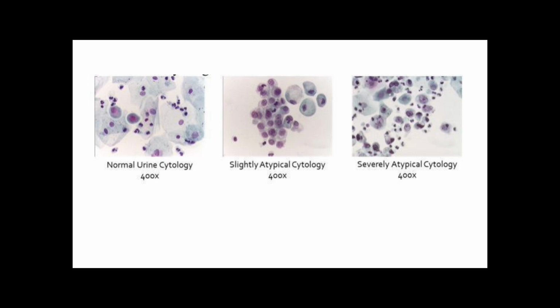The NC ratio is higher. The nucleus is larger and the cytoplasm is a smaller volume. When you look at the nuclear membrane, it is irregular, right, and intact.